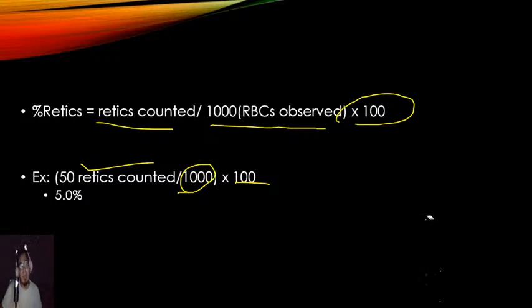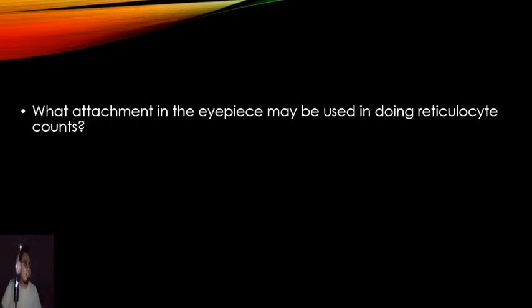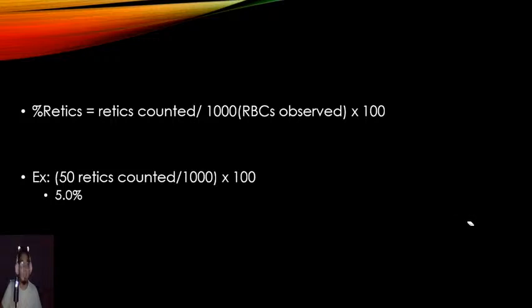Dun sa pinanggalingan ko sa MC, wala kaming machine. 'Di ba? Manual lahat. Tapos meron pang cases na, for example, nasabugan ng paputok yung 2 bata. Tapos massive bleeding. Ibig sabihin, bibilangin ko ng 1,000, bibilang ako ng 100 per field. Ano kayo, hilo? Ay, magbibilang ako ng 1,000 RBCs. Ano kayo, hilo? Alright, so ganon. May discrepancy, doon lang ako magmamanual. Oo. 'Di ba? At least alam niyo kung paano magmanual.